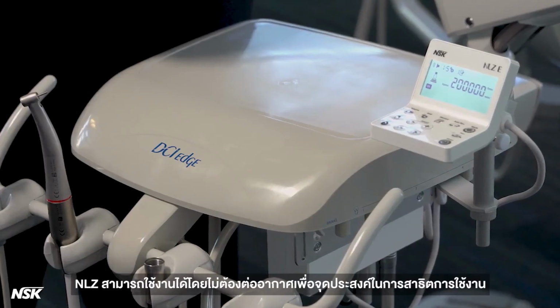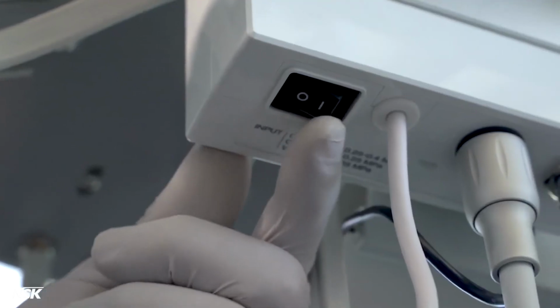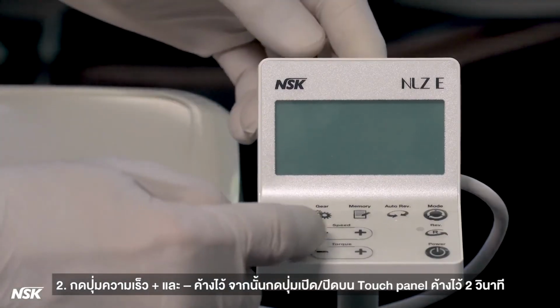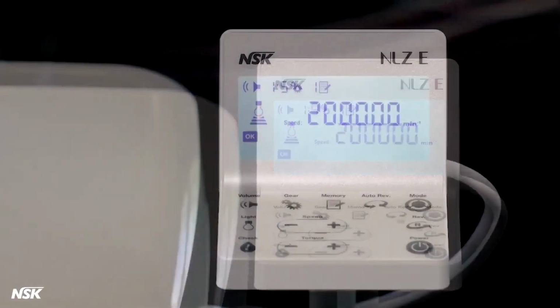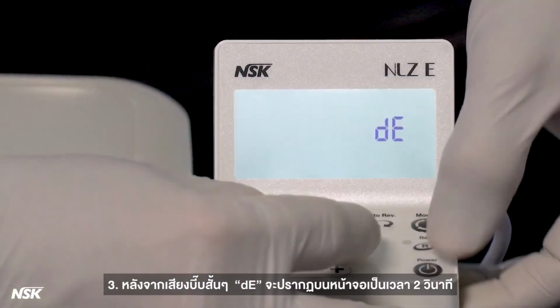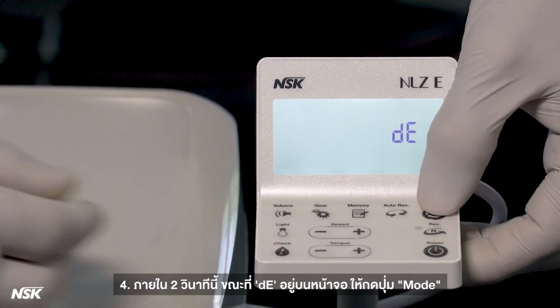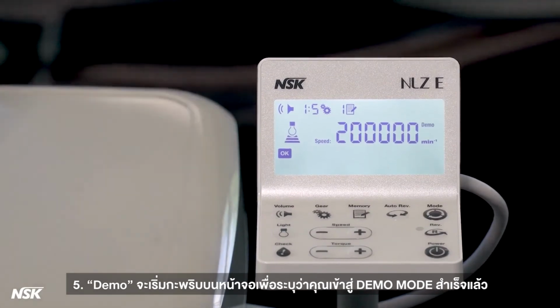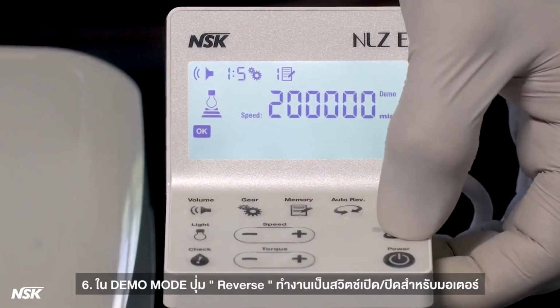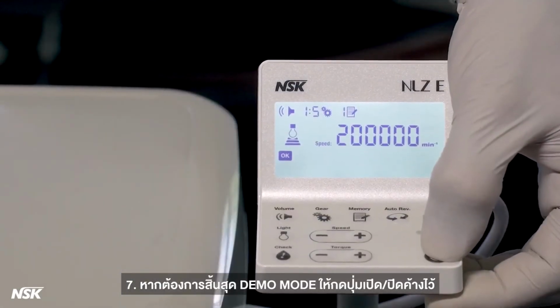Demo mode. NLZ can be operated without an air connection for demonstration purposes. Here's how we set up NLZ in demo mode. Turn on the module. Hold down the speed plus and minus buttons, and then press and hold the power button on the touch panel for 2 seconds. After a short beep, DE will be displayed on the screen for 2 seconds. Within these 2 seconds, while the DE is on the screen, press the mode button. Demo will start blinking on the screen to indicate you've successfully entered demo mode. In demo mode, the reverse button works as the on-off switch for the motor. To end demo mode, press and hold the power button.